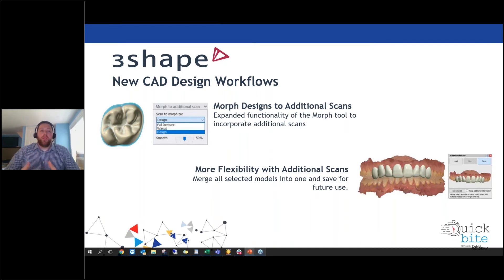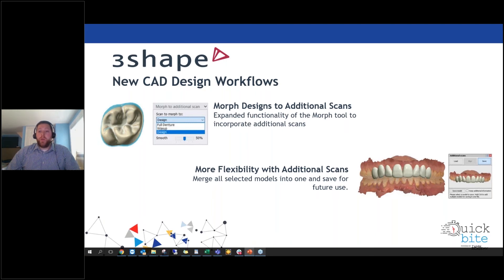A big change in 2020 was expanded capabilities for additional scans added to cases. The mirroring tool in the 3Shape Smile Composer has been expanded with a Morph-to-Additional feature that allows morphing of a design to any additional scans — including wax-ups, pre-preps, or mockups that can be imported. The update gave significantly faster and more stable results within the morphing process, making the tool easier to use during design manipulation.